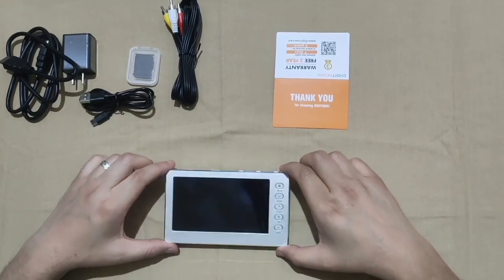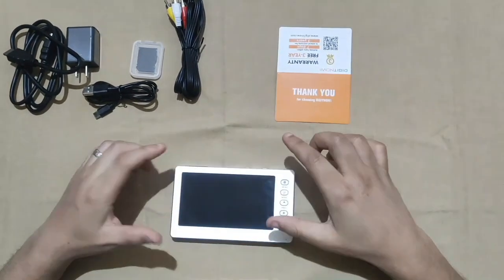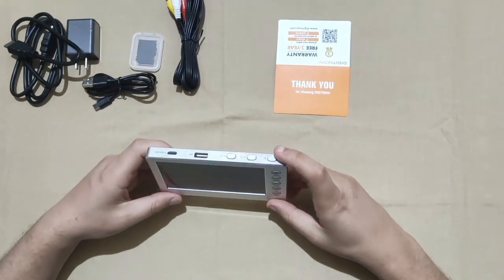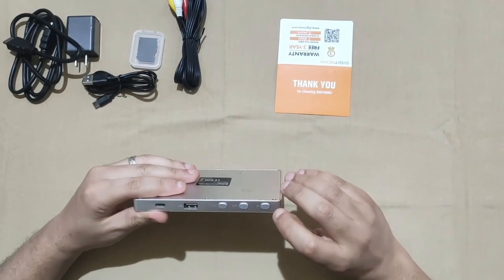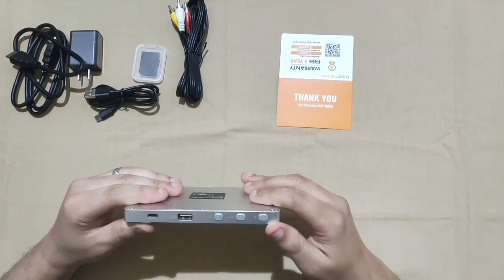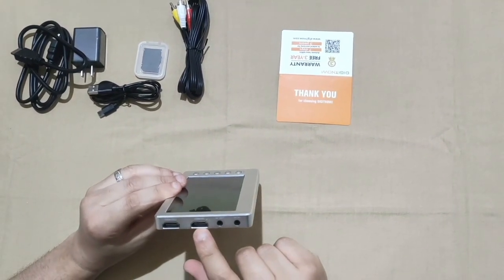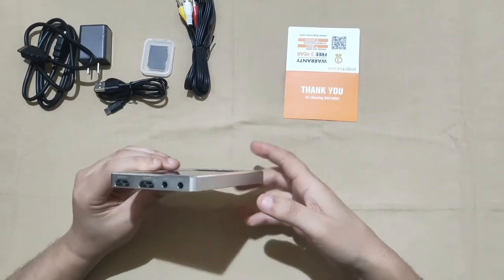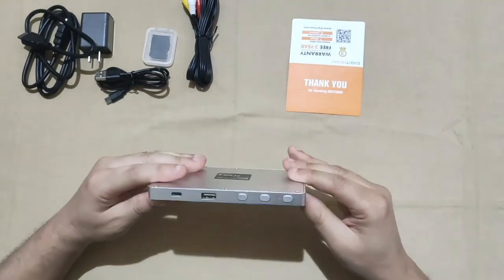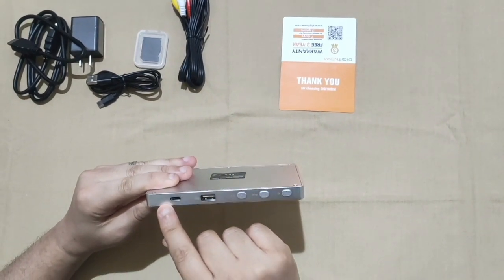Now let's review the video capture box. As you can see, the capture box frame is metallic. This is the power button. These sockets for HDMI out, HDMI in, AV out, and AV in. This socket for SD card. And this one for USB flash drive. And this socket for Type-C USB cable.